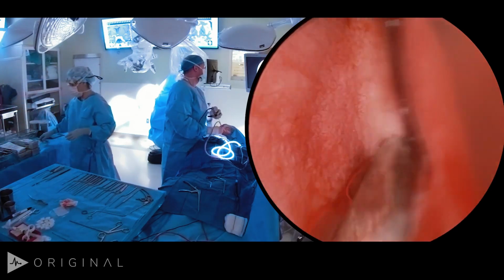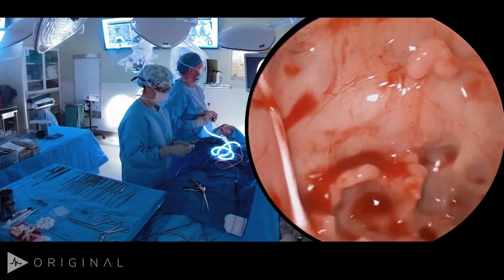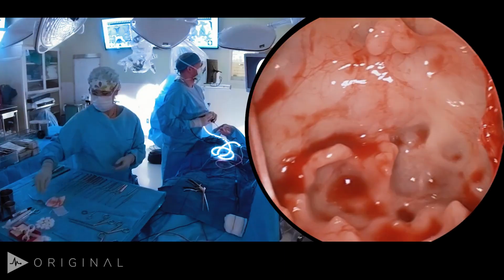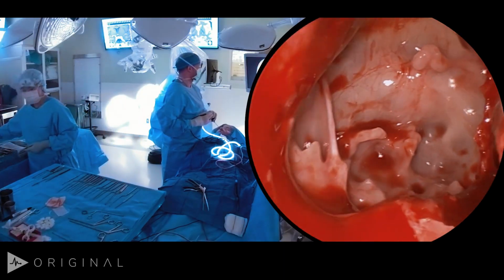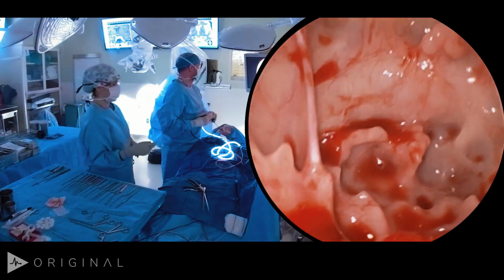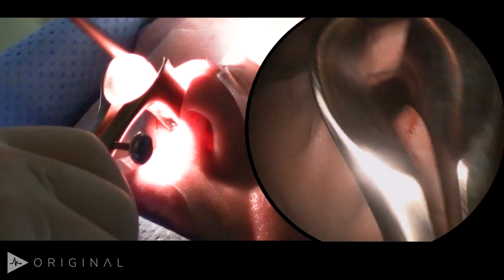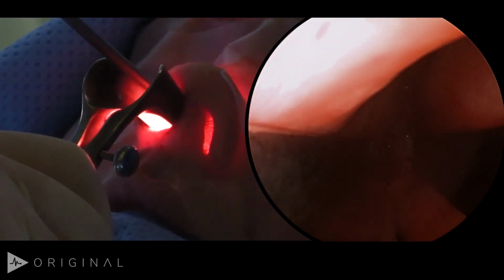Just checking out our other side, looks like no holes in our flap. So now we got a fairly good look at our sphenoid back here. That should be the sella. Out laterally, it's hard to see them with the 0-degree scope and because our exposure is not very wide, but you would be able to see the opticocarotid recess. So some people will dilate the nasal cavity a little bit with this before they put the speculum in, see if they can get themselves a little bit more room.